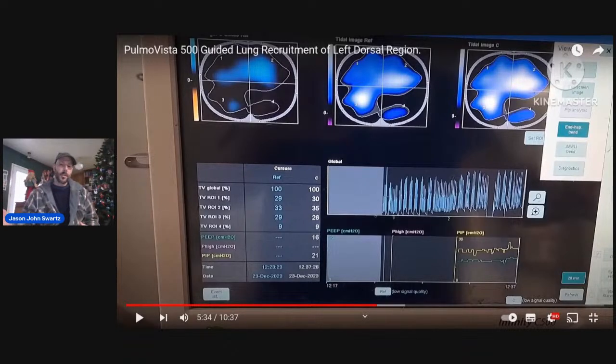So if we're not getting the result that we want at the bedside, we'll often transition to APRV. Usually by the time we leave the bedside, it opens up. I'm saying that because in the video I'm going to start talking like, well, it's not opening up. So it's 16, so maybe I'm going to try APRV, which is what we usually do.